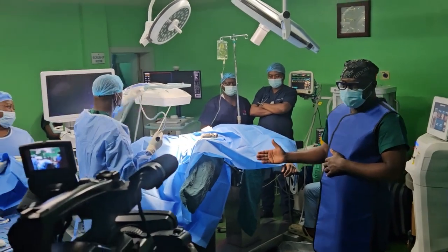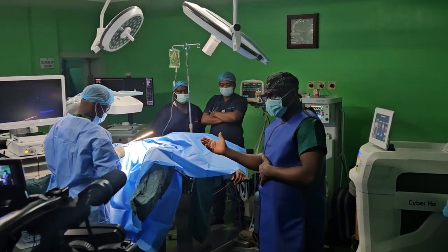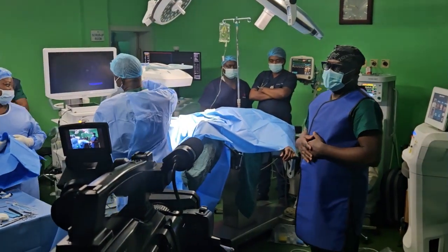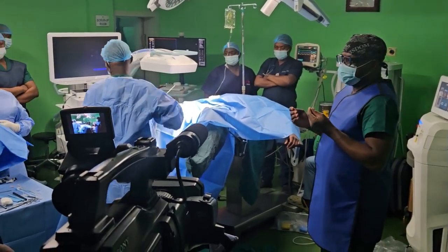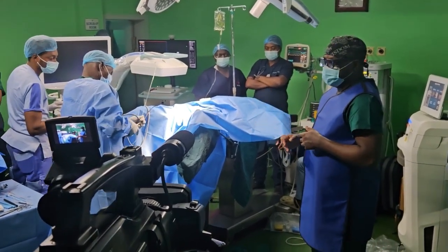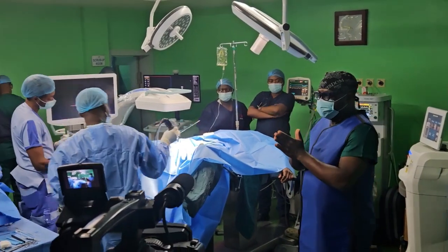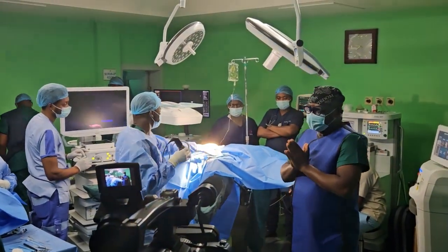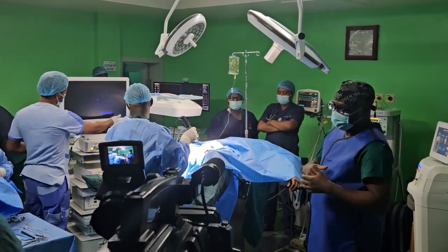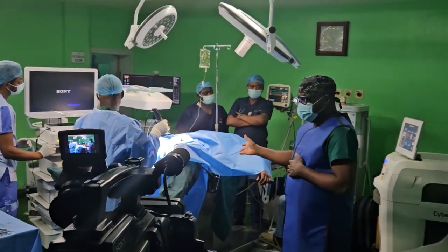All the key opinion leaders will agree that the placement of a ureteric catheter is mandatory for so many reasons. The opacification of the pelvicalyceal system, then it gives you easy retrograde access, so you need to stop, convert, put your stent and all of those things. Then the presence of the ureteric catheter within the ureter helps to prevent migration of your fragments into the ureter. Among so many other reasons, the lithotomy position.